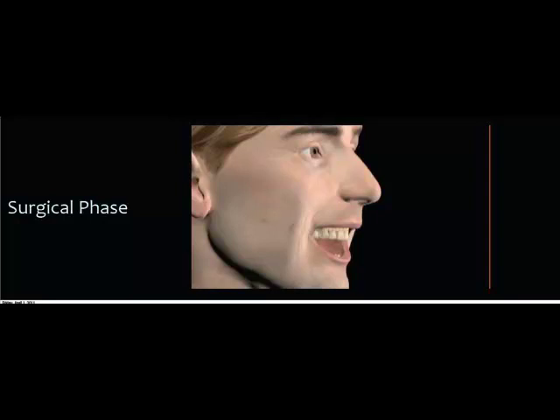Now the implants are placed in a manner to help reduce any movement or any pushing of the guide, so that the guide's position is always kept stable. Now we remove our fixture mounts and our anchor pins, and then typically in these types of cases we'll have a remaining tooth that needs to be extracted.